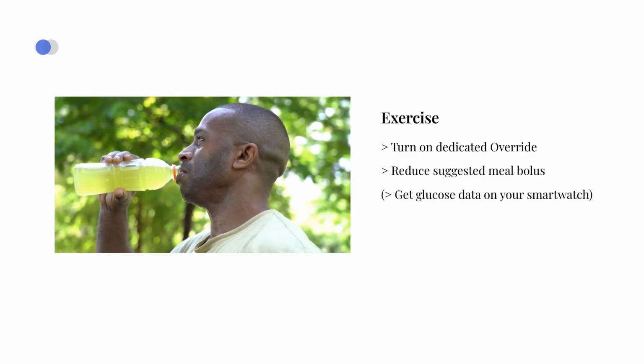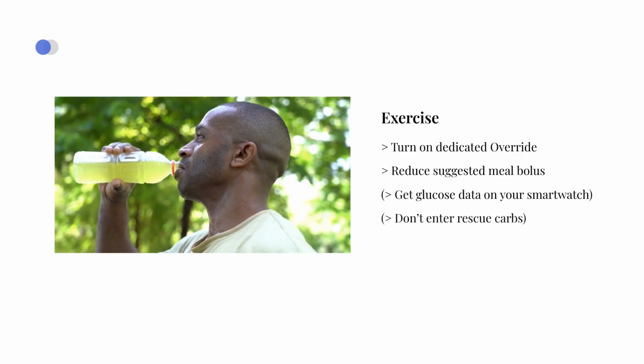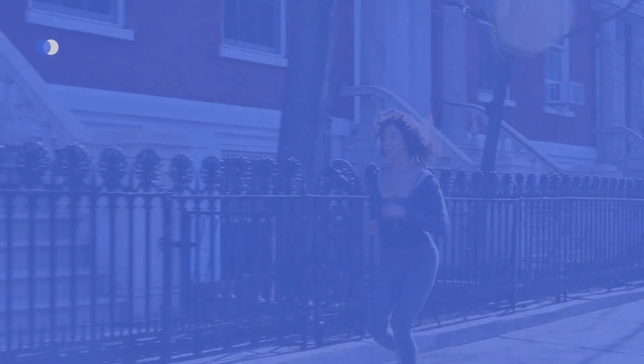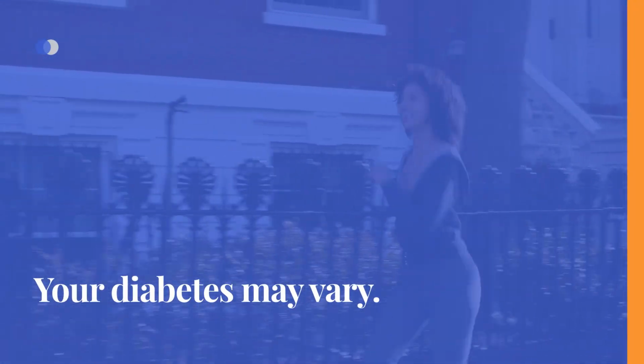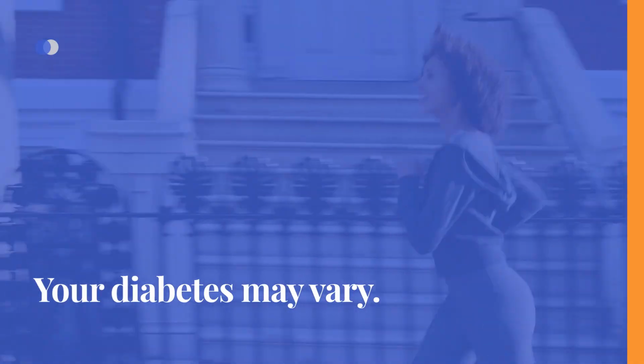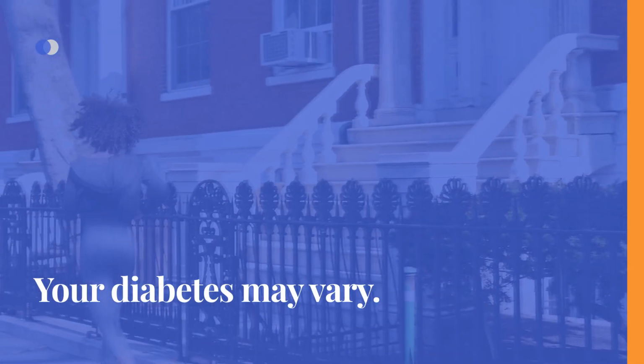If you consume small amounts of carbohydrates during physical activity, you do not need to enter them in the DIY Loop app. Remember that these strategies are starting points, and it's important to fine-tune your insulin dosage and carbohydrate intake based on your personal experience and observations during exercise.